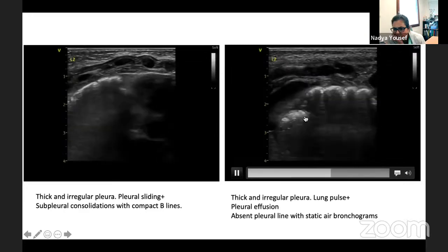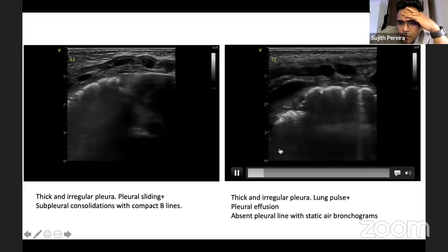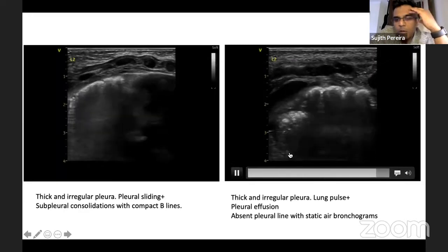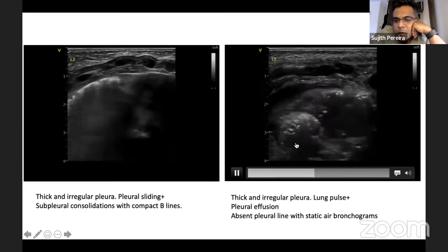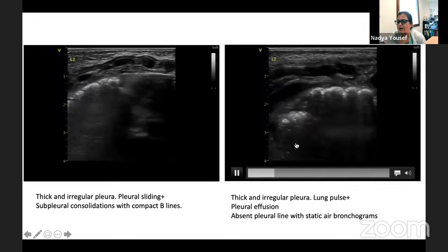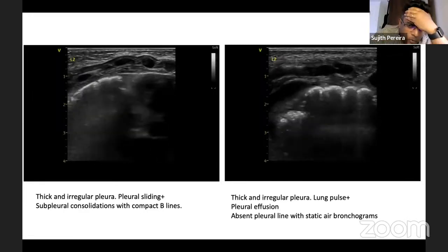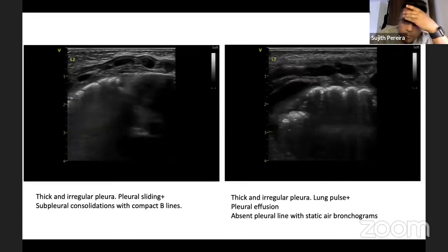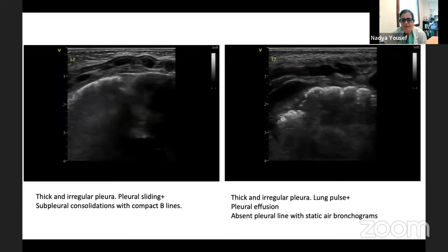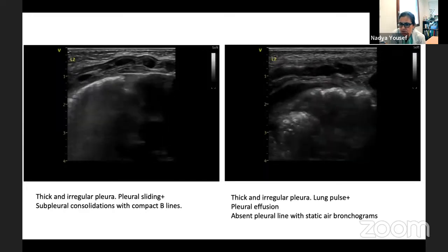I did put color on this, and it didn't light up. I didn't put a slide. So right at the bottom, there was a little bit of a vessel that I could see. But what you're seeing, this brightness here, there was no color going through. Not mirroring of the stomach, for example? No. My probe was just beside the heart, and it was tilted, so it was away from it. Yeah, that's really good having picked that up. We don't usually manage to do that. And this corresponds to the area where you have the opacity on the chest X-ray then.